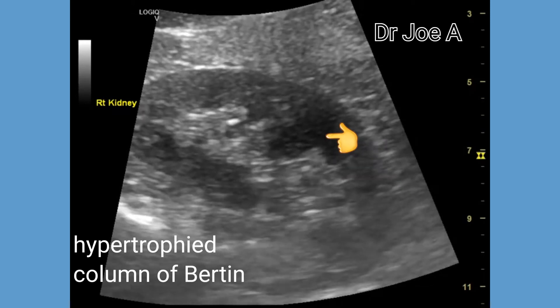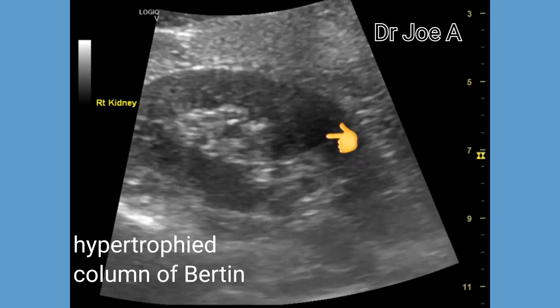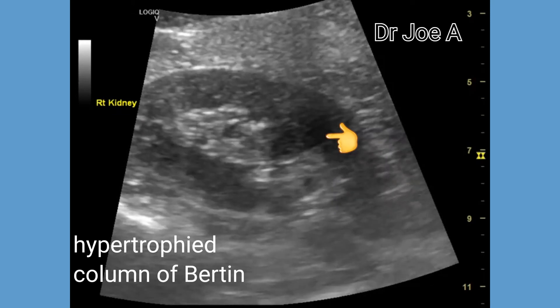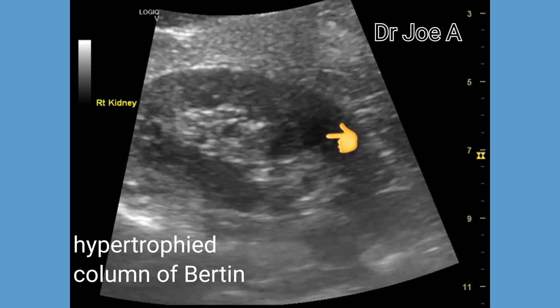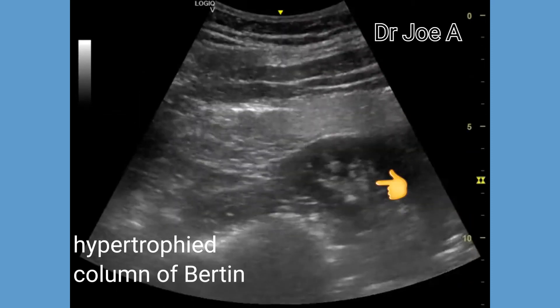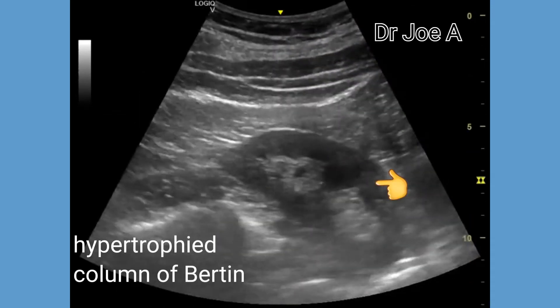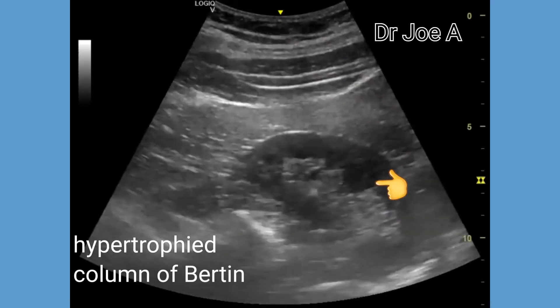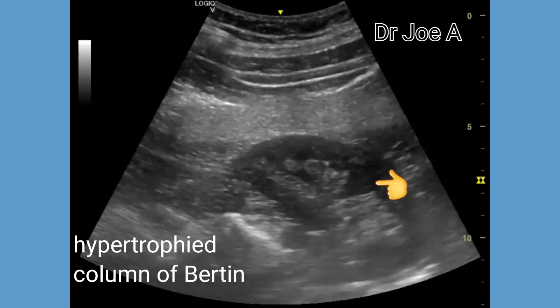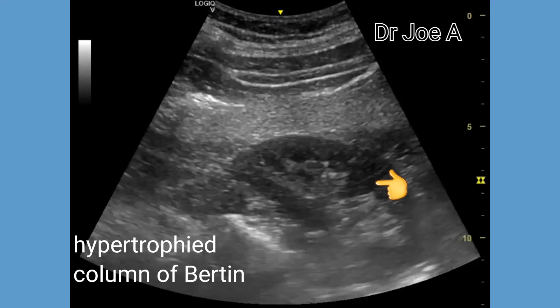The hypertrophied column of Bertin in this case is seen bulging between the renal pyramids into the renal sinus. This is a normal variant.